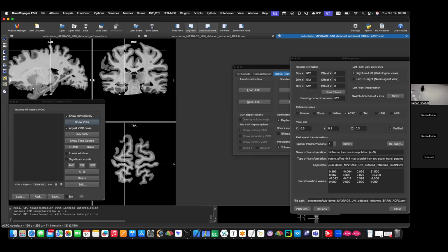Then what you can do is you can revert everything back to 0.3. You just see it. I was doing load transformation, and something happened, but the name of the file is different.